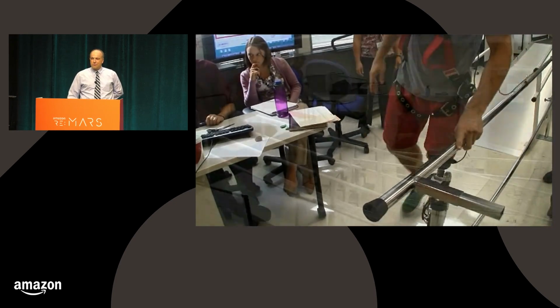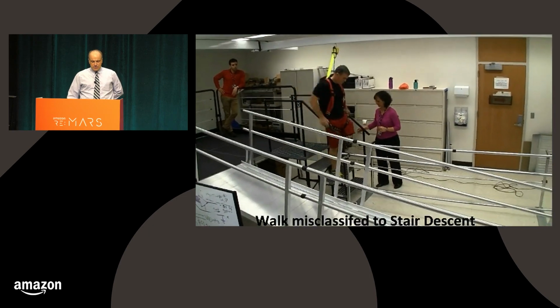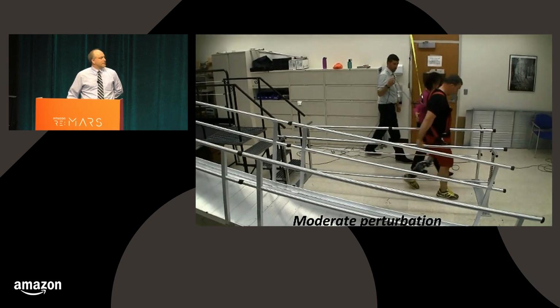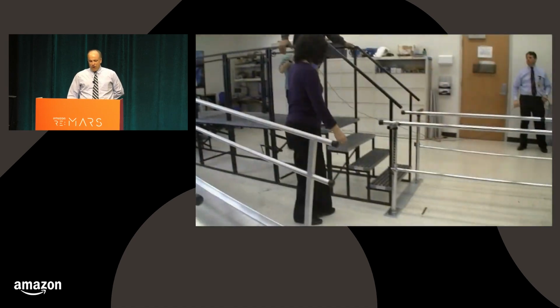Kind of jackknifed over the top because it didn't get the prediction at the right time. Again, that's the trickiest one to get in our experience. If it doesn't transition at the bottom, it feels like he's walking in a hole. He kind of went down on it. These are things that can go wrong if we're not accurate.